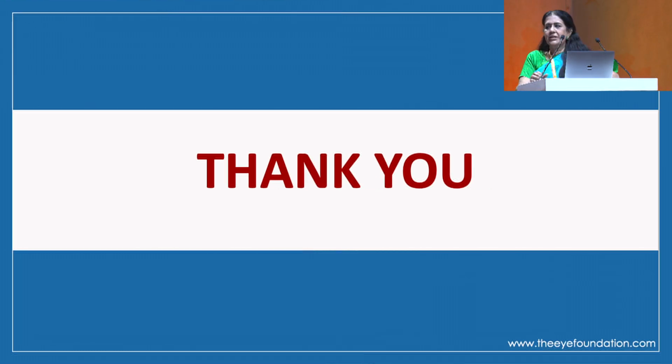Thank you very much. These were just different ways which I tried to show you all, to understand that even if there's a PC blowout, how you could manage your surgery, be it an IOL scaffold or an SICS or a gentle phacoemulsification. Thank you.